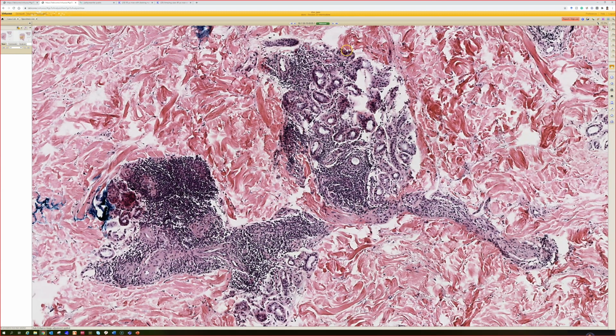Yeah, and also things I see, I feel like I see peri-eccrine lymphocyte aggregates also in perniosis, which of course has a lot of overlapping features with lupus sometimes. And I've also seen it in bug bites, although you would expect to have a lot more inflammation up top too, and a lot of EOs, but I feel like I often see peri-eccrine lymphocyte aggregates.